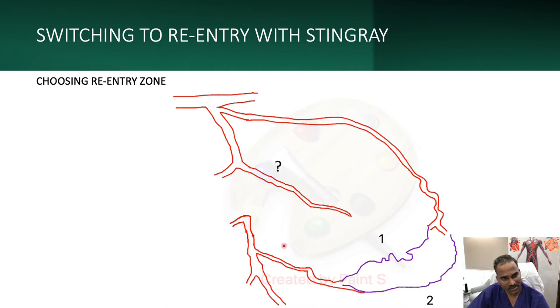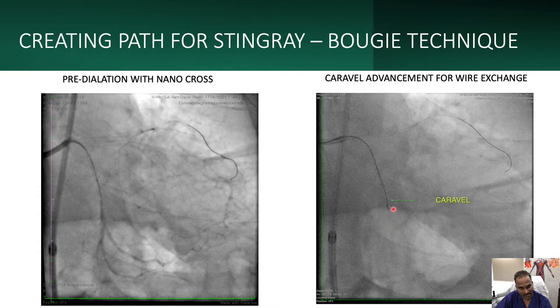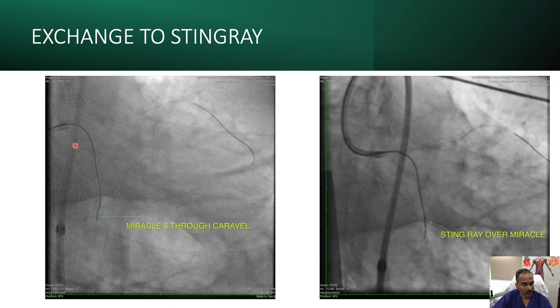To identify the re-entry zone — before the OM3 junction — we selected a good re-entry point. To create a path for the Stingray, I first took a NanoCross balloon and performed dilatation at the proximal cap. Then I advanced the Caraval microcatheter over the wire to the re-entry zone. Once Caraval was advanced, we exchanged to a Miracle 6 wire, which was positioned at the re-entry zone, and then the Stingray was brought in by exchanging Caraval.